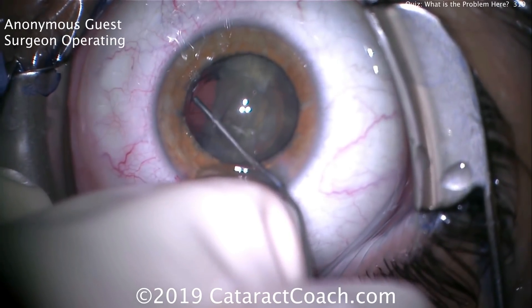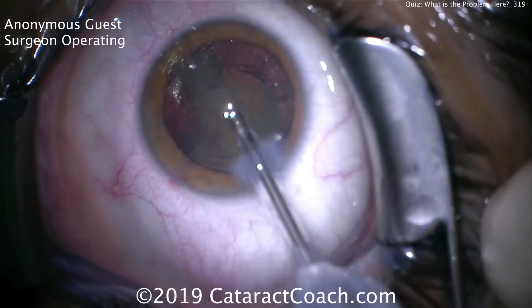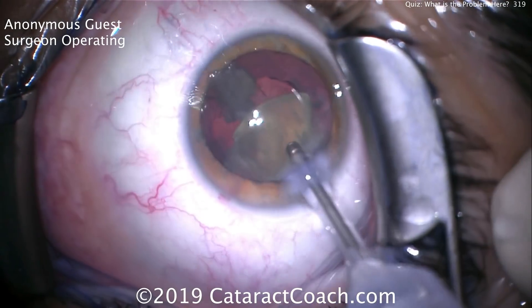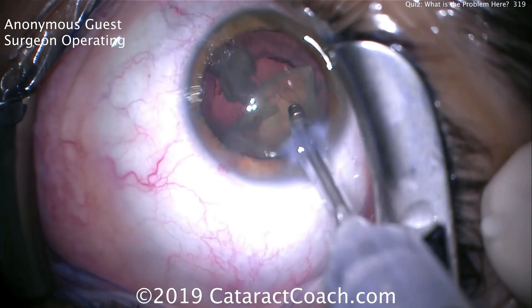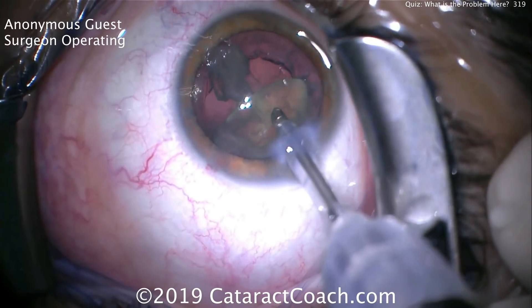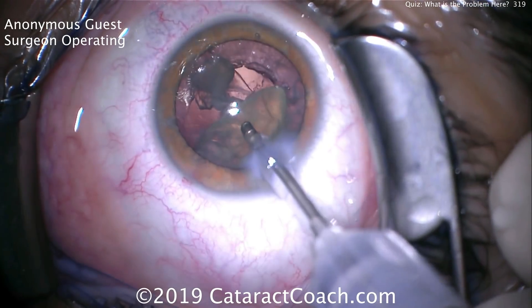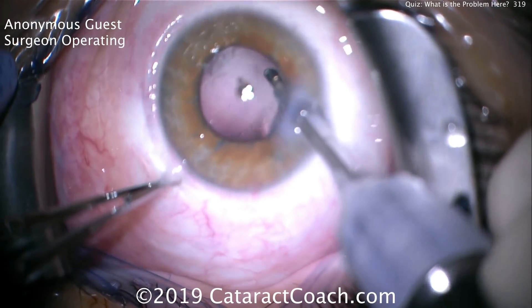That's a nice technique — I like that. Now it's time for the phaco probe going inside the eye, and this soft lens can be emulsified relatively easily. So far so good, I don't see any issues. But there's going to be a serious problem in this case, and I want you to tell me when you realize it. Time for cortex removal.